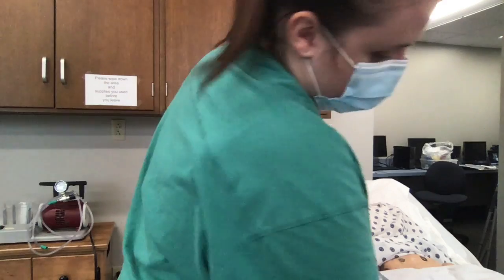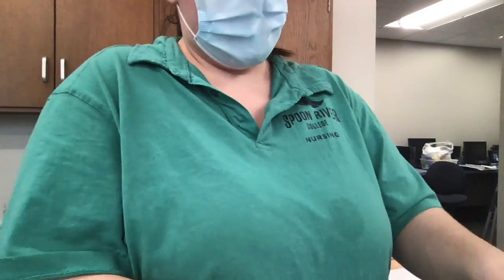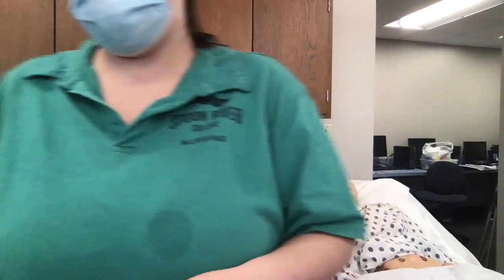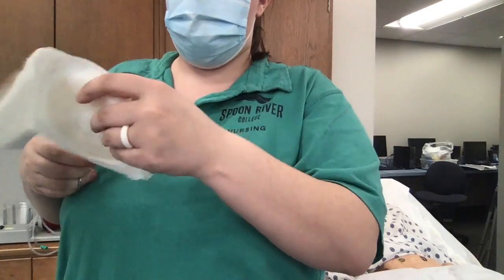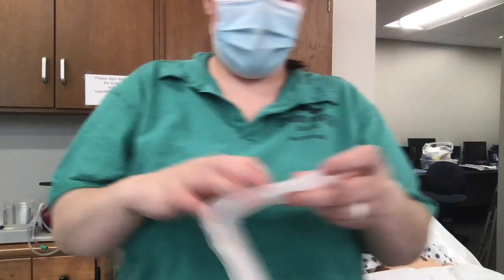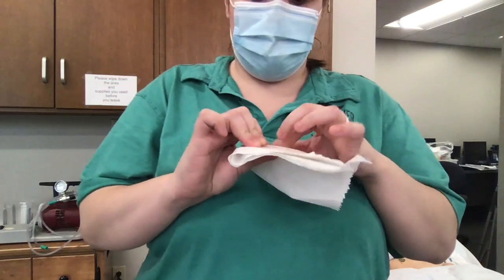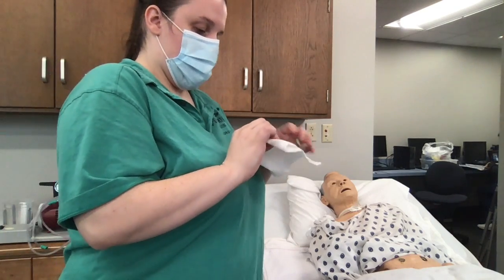So I would then take a new wafer, and I would take and measure from my measuring chart and take a pen, draw around, and then I would cut appropriately, cut that size out, and then I can take and kind of stretch it a little bit, kind of do one of these things to make it a little smoother. You don't want the edges so jagged. Okay.